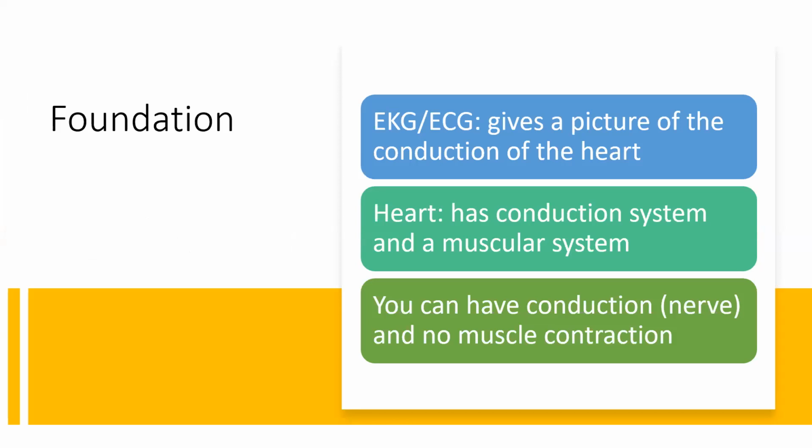So let's talk a little bit about the foundation of EKGs. You may see two different terms. You may see EKG, you may see ECG. These are both the exact same thing. It's a picture of the electrical conduction, or the electrical activity, of the heart.